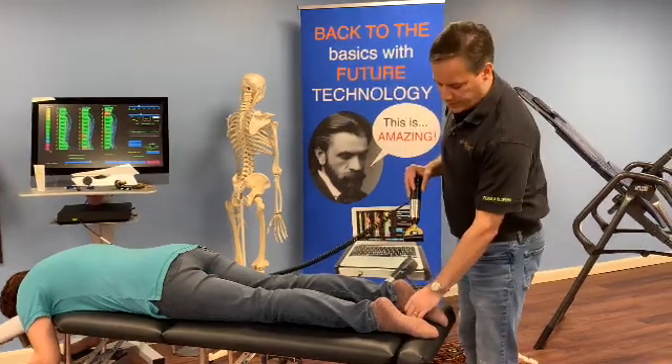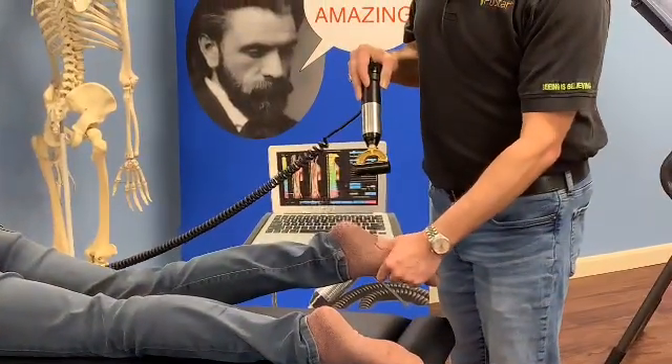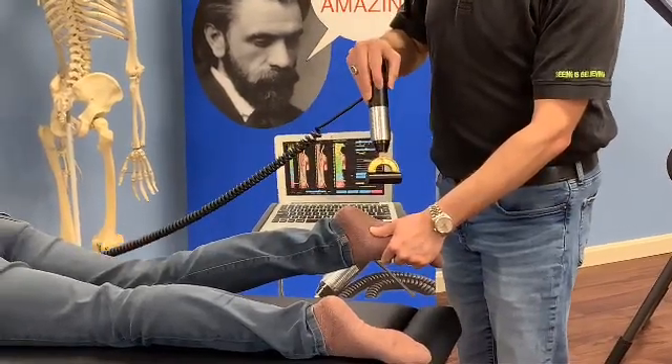When we're working with long regions to either strip those muscles or work across the muscle fibers, we want to use the myofascial mode because we can control the rate depending on how hard we press on the impulse head.